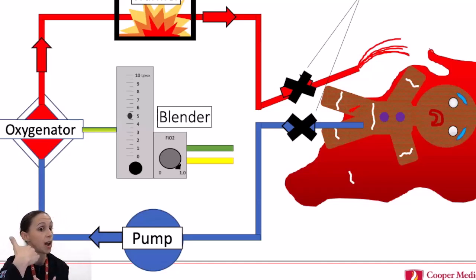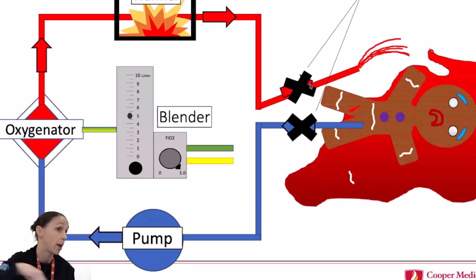Since the cannula is not out, you want to go back on ECMO, but you need an airless connection. So how could you do that? Well, again, ECMO ninja John, because it's the return cannula and it's under positive pressure, unclamped the return cannula so it was bleeding back, and then we were able to establish an airless connection and go back on pump.